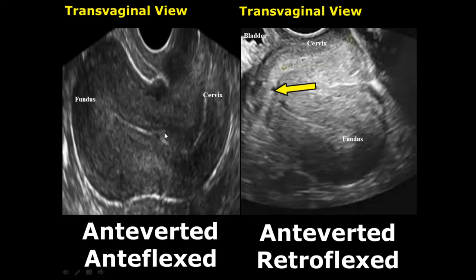And anteflexed — the body of the uterus is bending anteriorly. The bladder is supposed to be in the top left corner of the image. And here we have the anteverted and retroflexed combination.